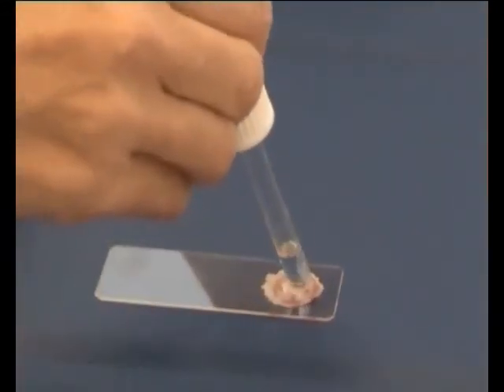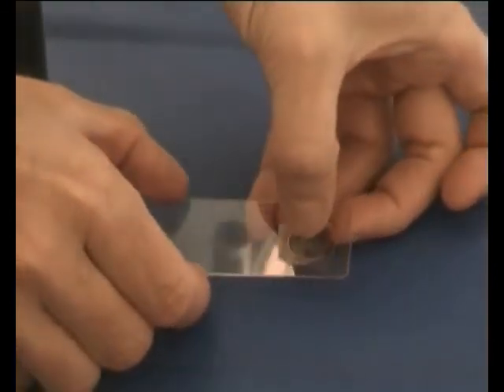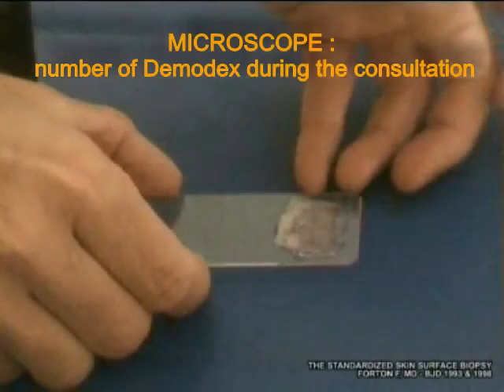After removal from the skin, the sample is clarified with 2-3 drops of immersion oil and then covered with a coverslip. We can then go to the microscope and count the number of demodex during the consultation.